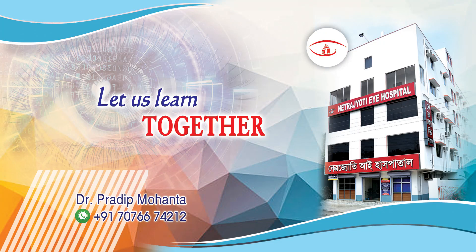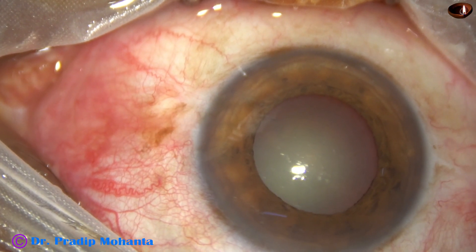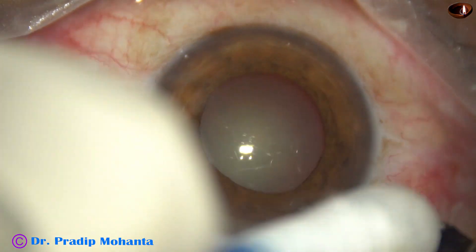Friends, welcome to my workplace at Ranaghat, West Bengal, India. In this video, we are going to see what we can do to avoid injury to the iris when the pupil is not well dilated.